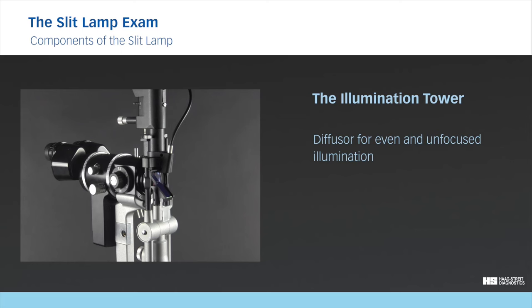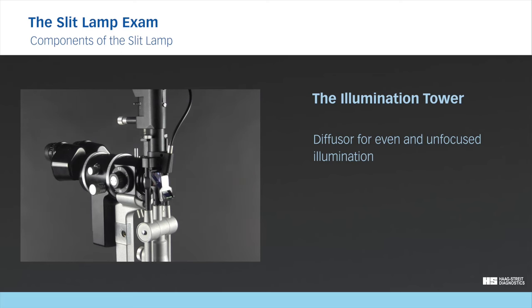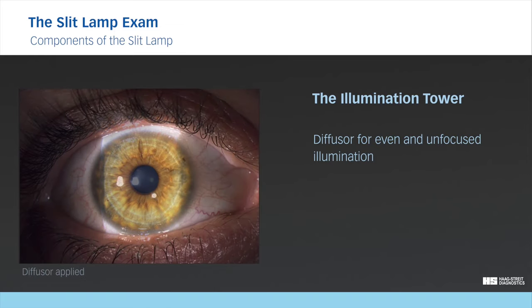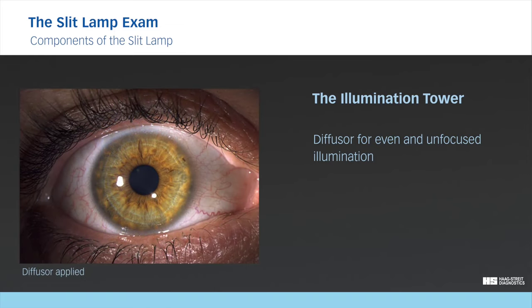Most slit lamps include a diffuser, which is engaged by simply lifting it into position in front of the mirror. The diffuser creates an even, unfocused illumination that covers a wide portion of the view, which is especially important when making images.